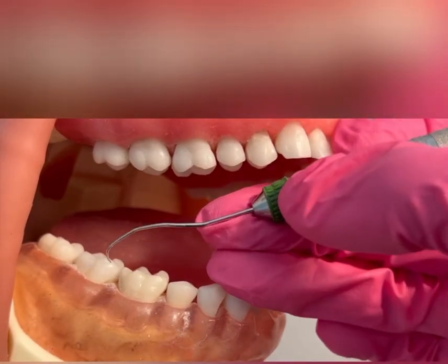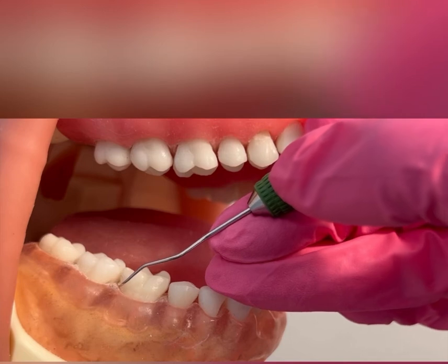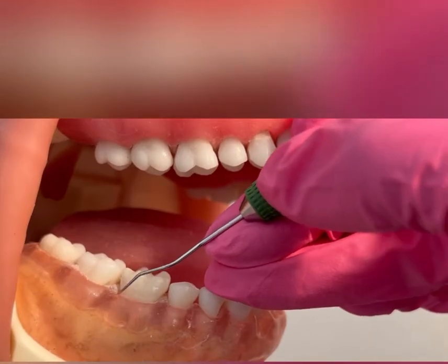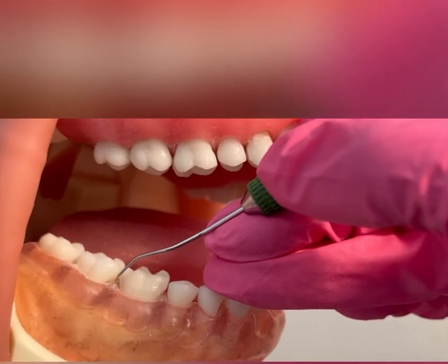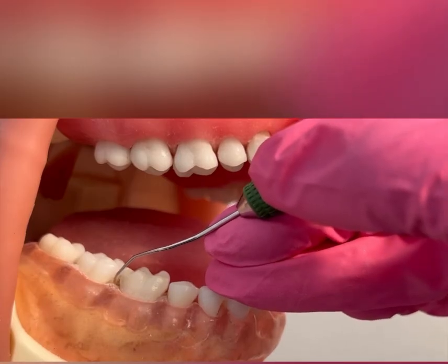Once I finish tooth number 31, I'm going to now explore tooth number 30. Maintain your modified pen grasp, intraoral fulcrum, good ergonomics. I'm adapting to that distal buccal line angle, going to use overlapping vertical strokes, working my way into that distal interproximal, going 51% — more than halfway into that distal.